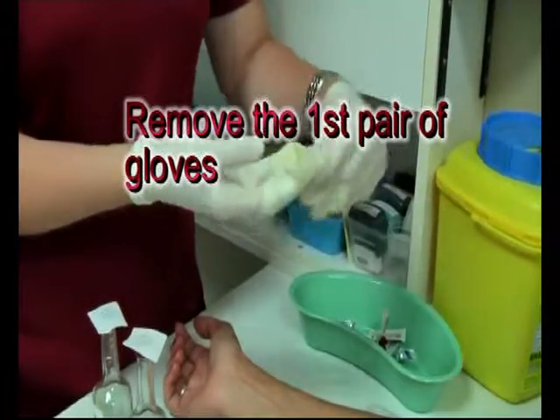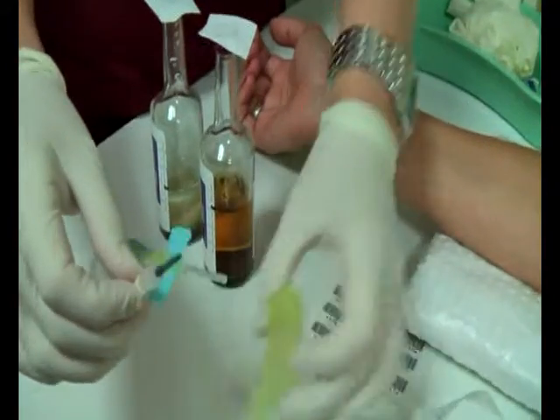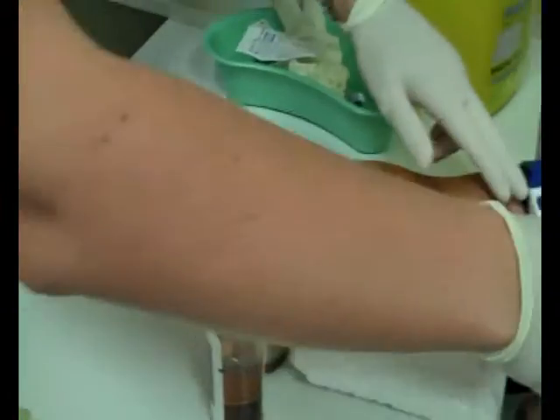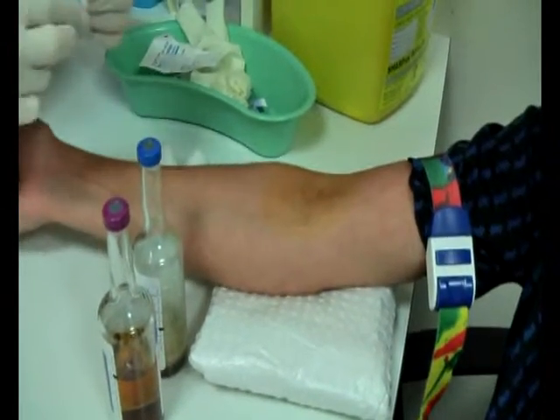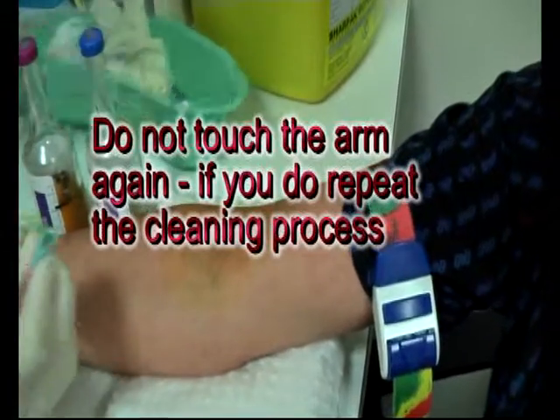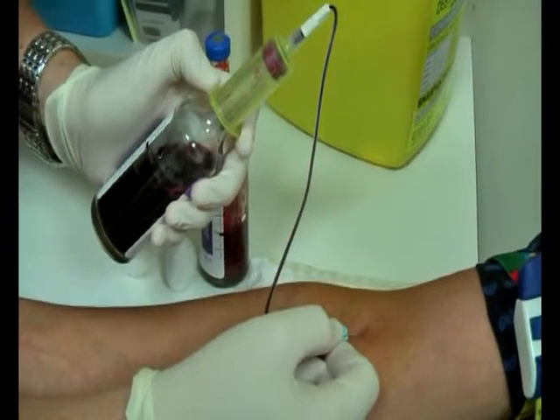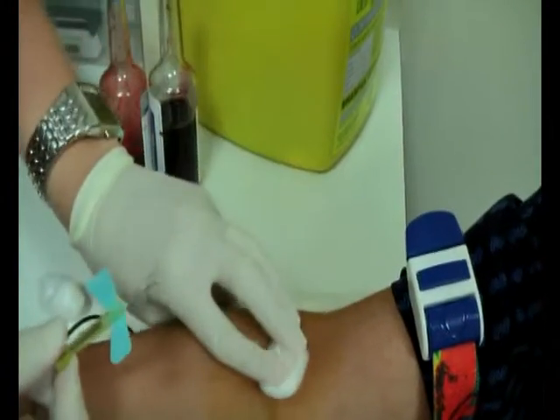Get rid of your dirty gloves. Put your needle together. And we're ready to go. Press there.